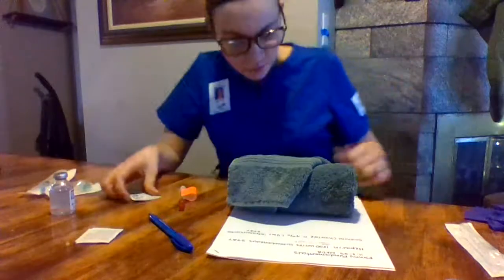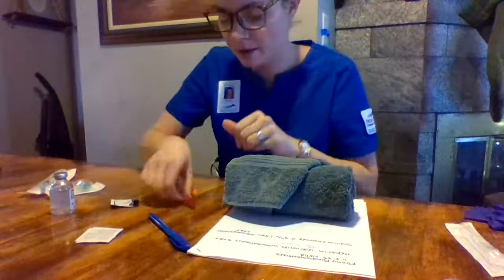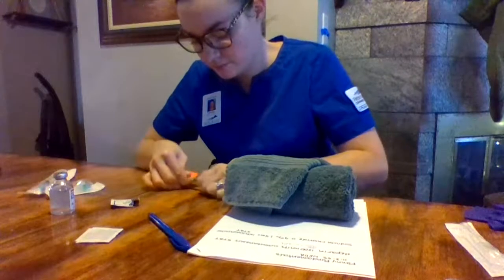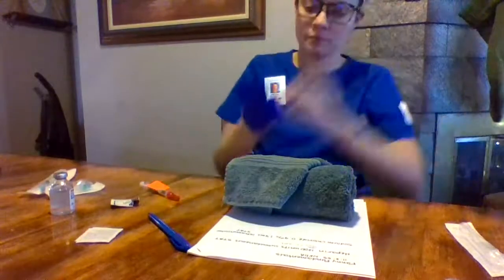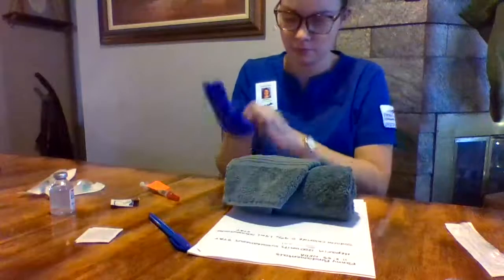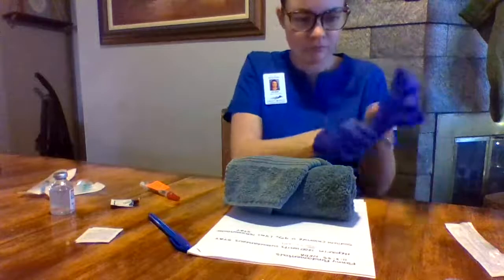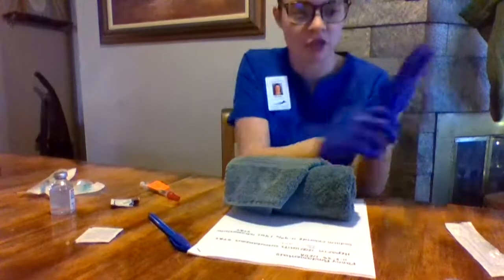Okay, I'm going to get my supplies ready, so I'll open up an alcohol pad, loosen the cap on my syringe, and put on some gloves. Then I'm going to choose the location for the subcutaneous injection.